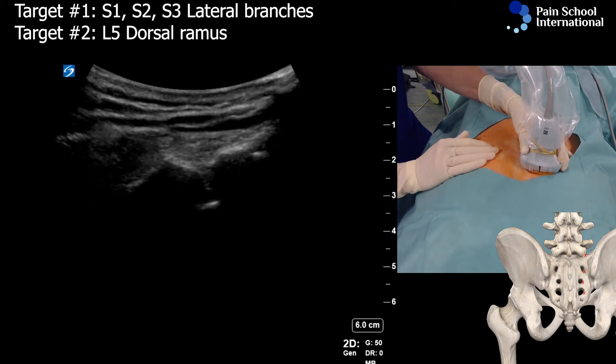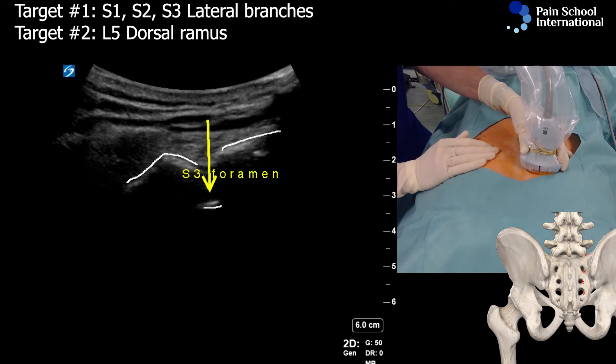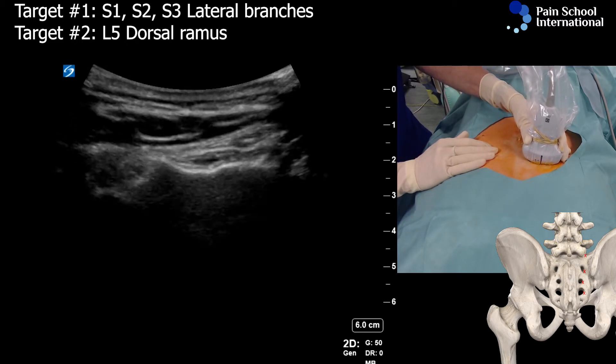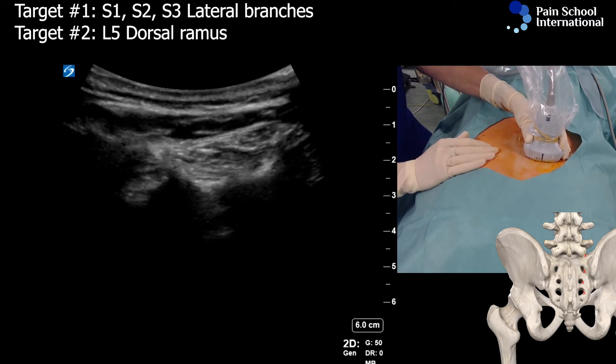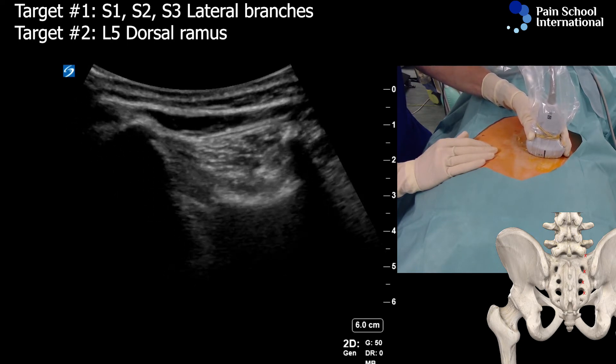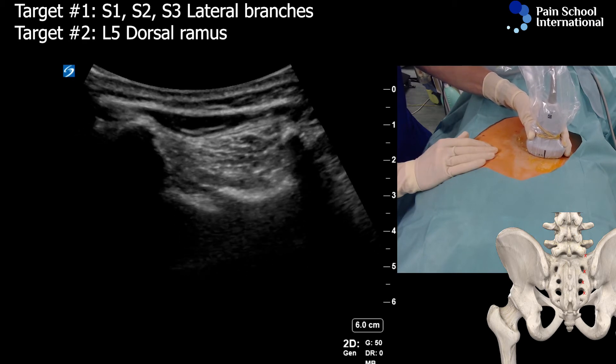We can visualize the next opening on the bony surface — that's going to be S3. Let's go for S1, so S2, sliding cephalad, and here you can see the opening for S1.